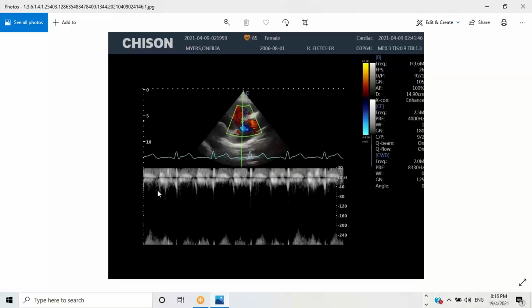Of course, your ECG, and you see a hint of a flow right there, or there's an envelope right there. So this is the tricuspid regurgitation in color, varying shades of blue, and it's blue because again your transducer is right there.